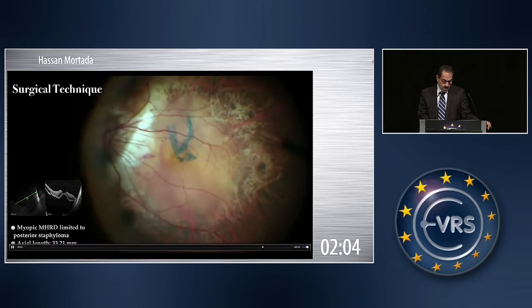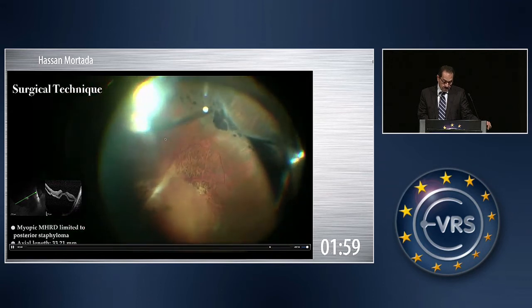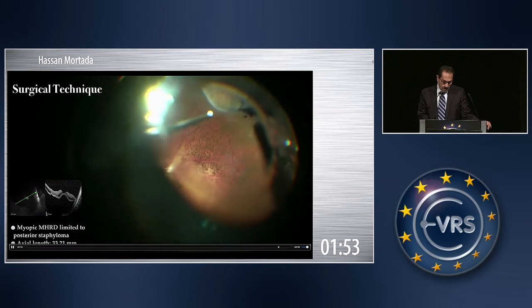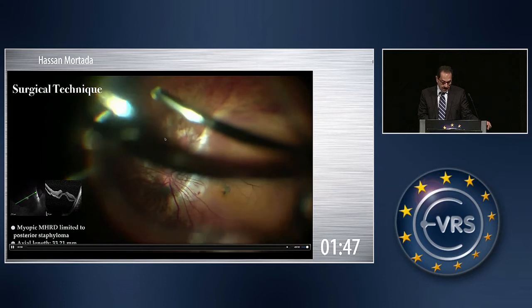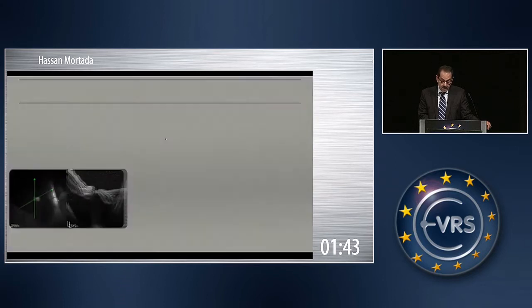This is the flap. Base vitrectomy is, in my opinion, very important. I think air is sufficient because the size of this globe is huge and there is no need to use a gas.